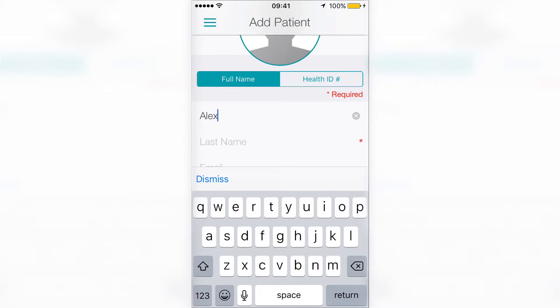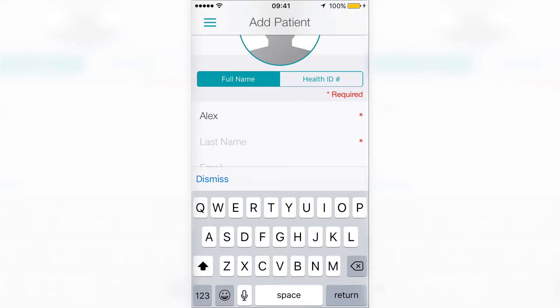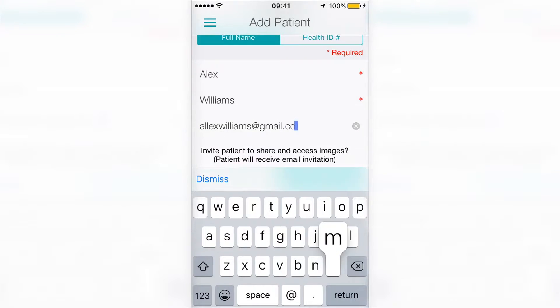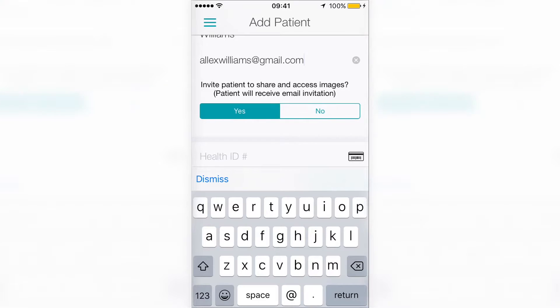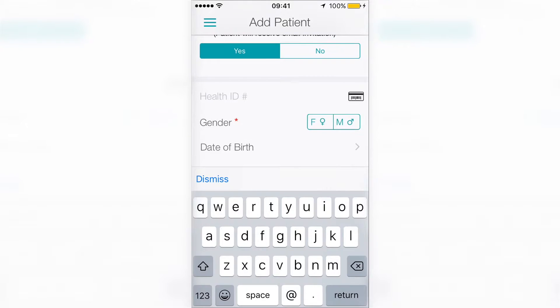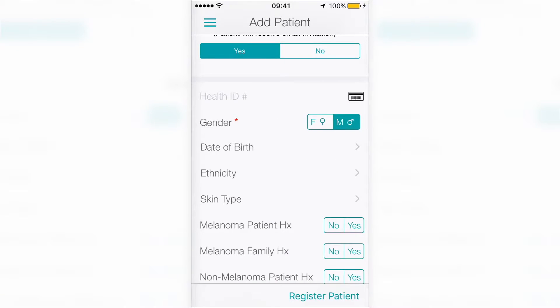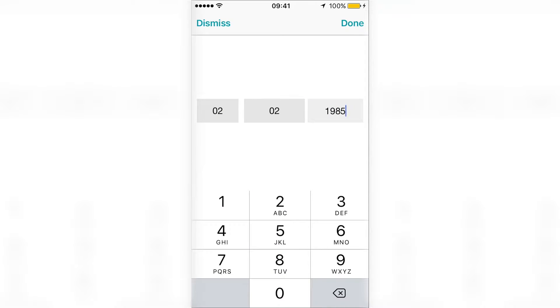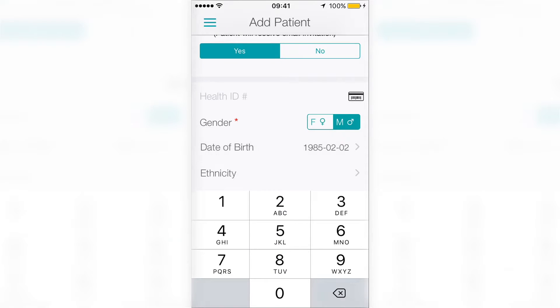If you want to invite your patient to have access to their images, please make sure you are entering a valid email address and selecting Yes on Invite Patient. You can scan the patient's health ID, type it in, or register them using their details such as full name and birth date.